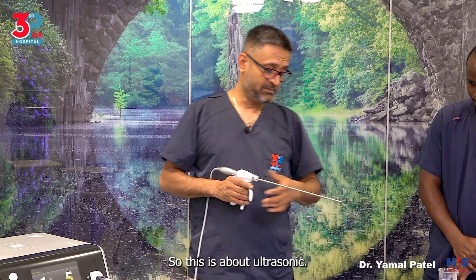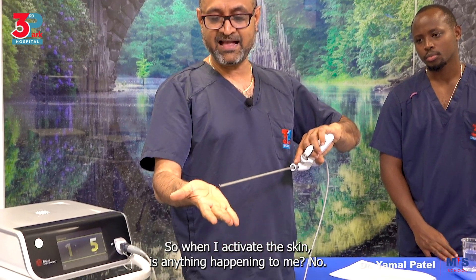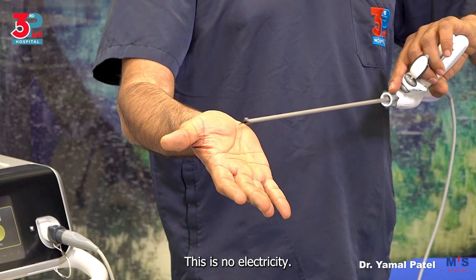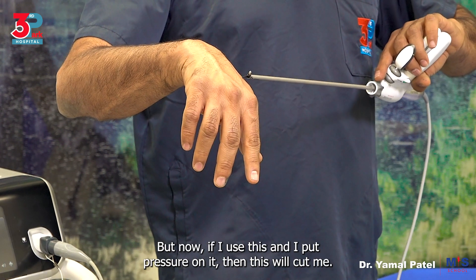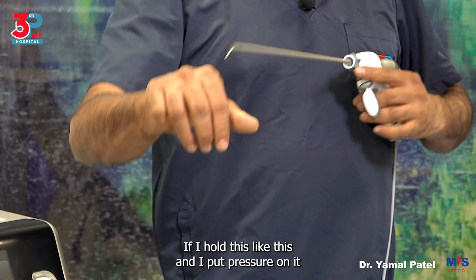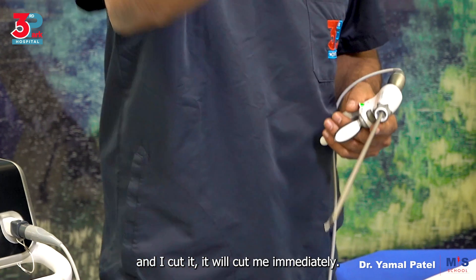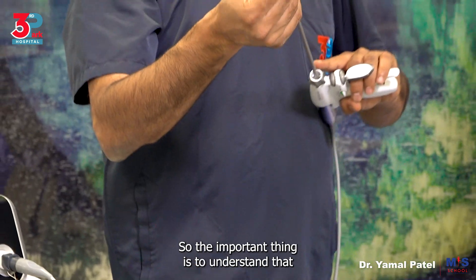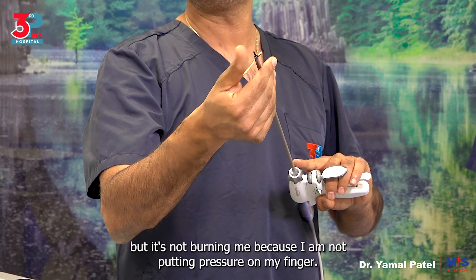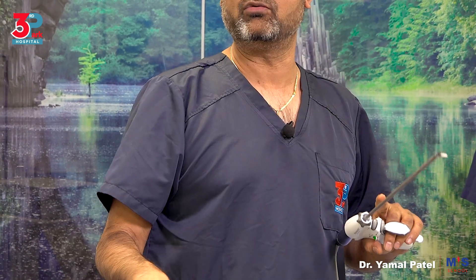When I activate this — is anything happening to me? No, look, I'm moving it, I'm active, and nothing is happening. This is no electricity. But if I put pressure on it, then this will cut me. If I hold it like this and put pressure on it, it will cut me immediately. The important thing is to understand that this blade is vibrating and I can touch it, but it's not burning me because I'm not putting pressure on my finger. If I put a bit of pressure like this, it will cut through. So ultrasonic works on frictional energy — when you press it against the active blade, it will cut through.